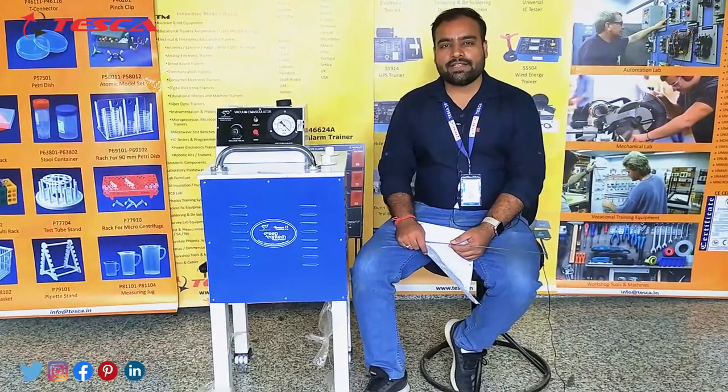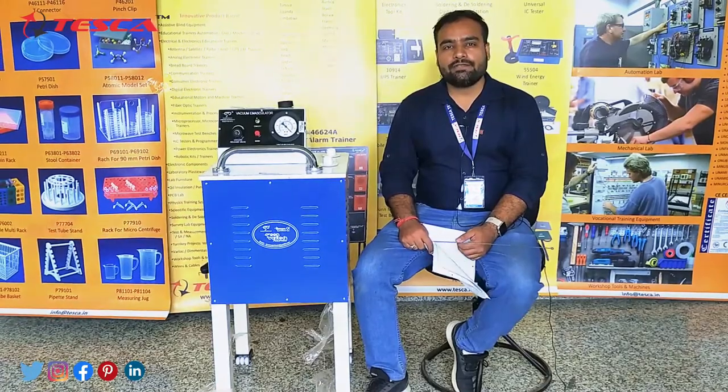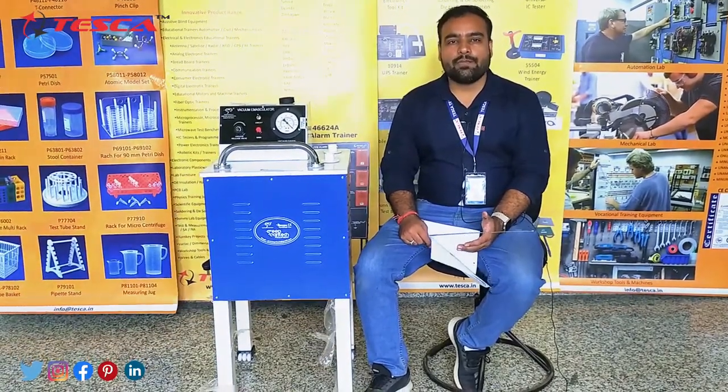Hello guys, welcome back to Tesca Technologies Private Limited. My name is Shivam Vijay, and today in this video I am going to give an explanation of the working of the rice vacuum emasculator.